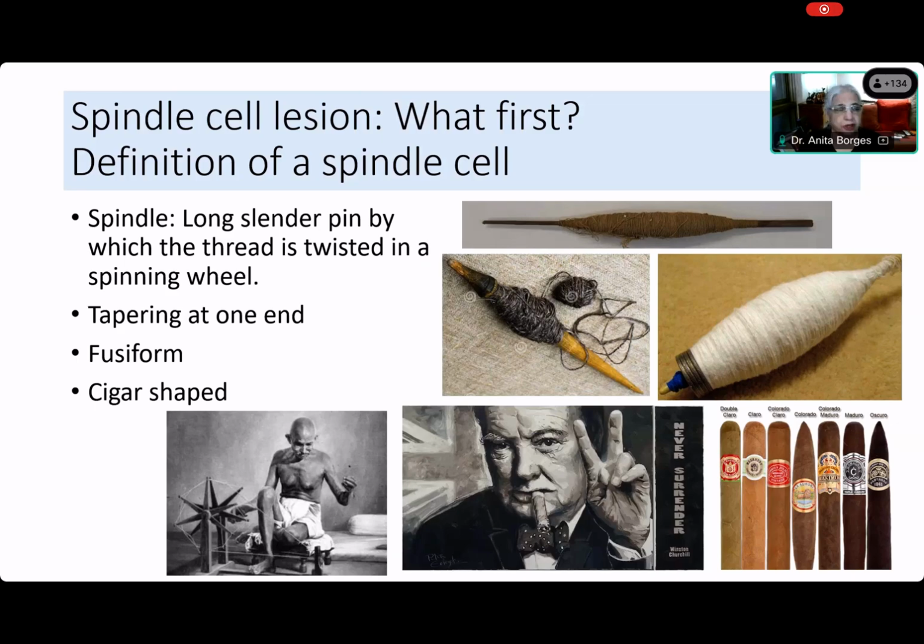You're only interested in whether the nucleus has got a spindle shape. Is that right, Elsa? No, ma'am. Spindle cell is elongated with the nucleus. The size is the length of the nucleus is 2 times the breadth of the nucleus. Okay, so you believe that a spindle cell is an elongated cell which has a nucleus that is actually spindle, right? That's what you said.